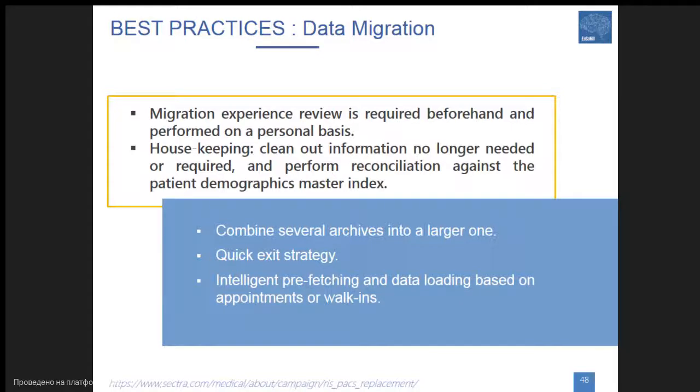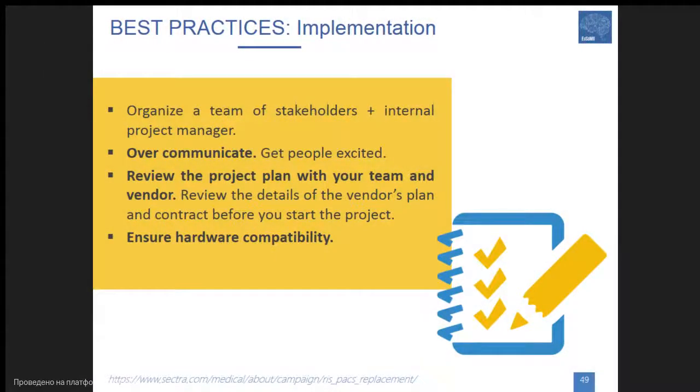So migration also includes cleaning out information which is no longer needed or required, and it also includes reconciliation against the patient demographic master index. With this, you combine several archives into one large one, and you can provide for radiologists intelligent prefetching of the images available in the system.